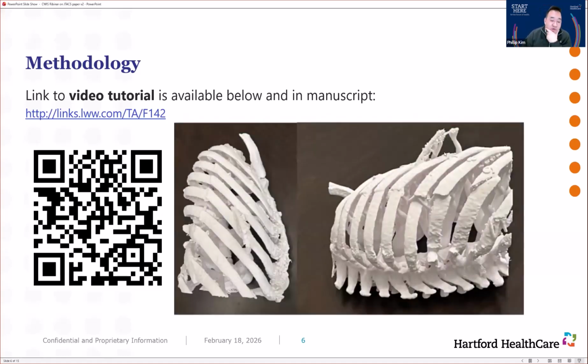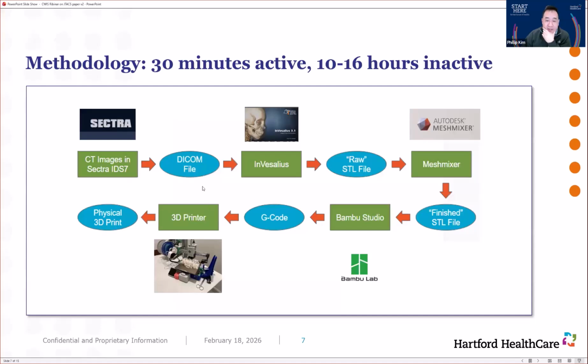All right, just to go over the process real quick, it basically involves first downloading the CT images, the DICOM files that many of you may be aware of from getting CDs of patients. That includes the images of the CT scan of the chest. You can use a free software called InVesalius, an open source software made in Brazil, that converts it into the density that you want. We can select bones or the density of the bones. If it's osteoporosis, we increase that range.